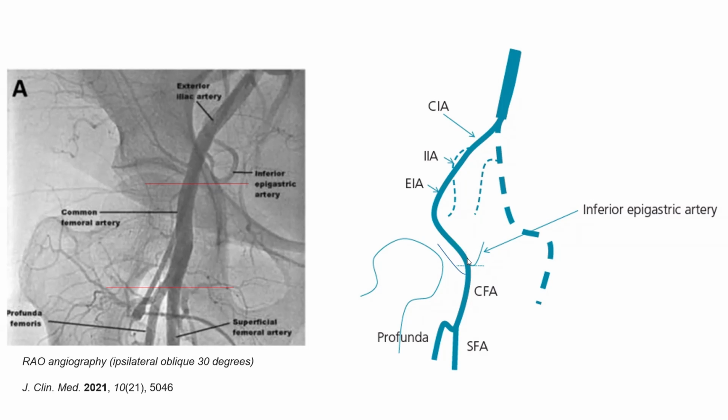So a stick even just above that inguinal ligament is actually a stick into a loose, non-constrained space where you can bleed massively and sequester a large amount of blood before you get any self-tamponade. So you can have a large free-flowing bleed with any stick above this area.